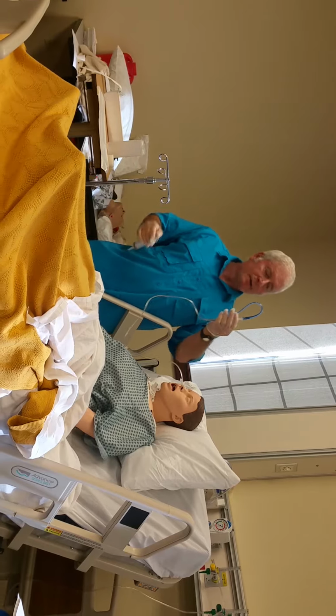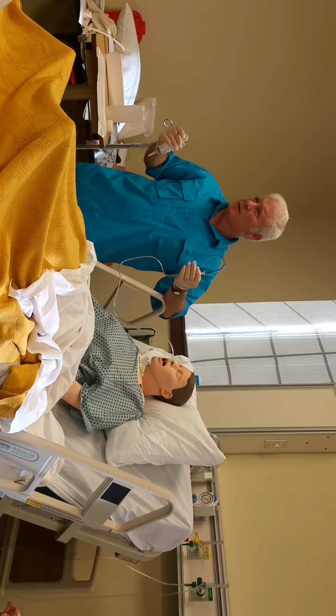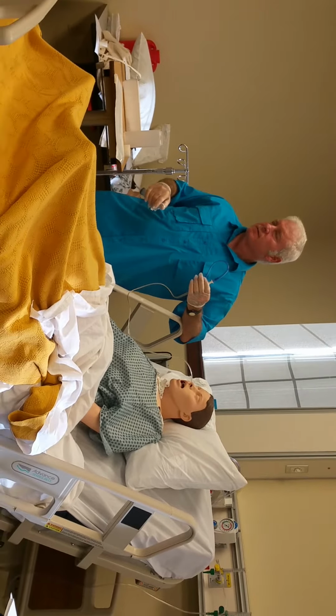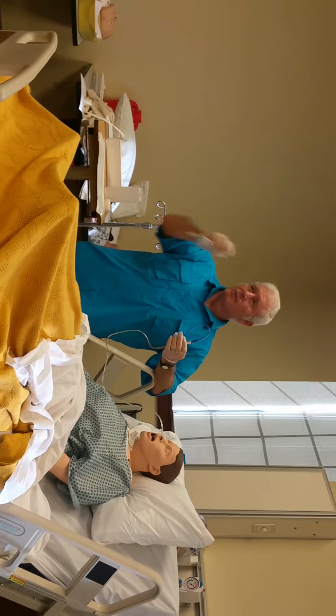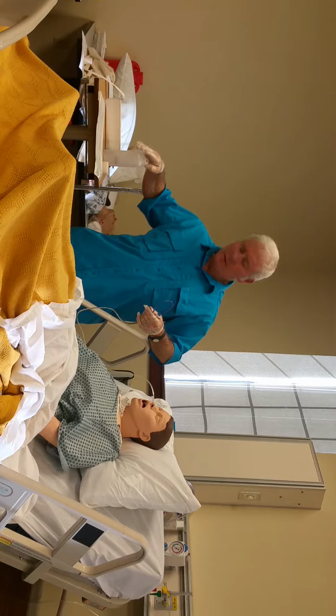Don't forget that part, and then you always flush after you get done with the feeding. You flush 30 mils of water. The book may say 30 to 60. I just do 30, okay? After you're done with medicines, you flush after everything, okay? Because we don't want these holes to clog up. You can look at your NG tube.